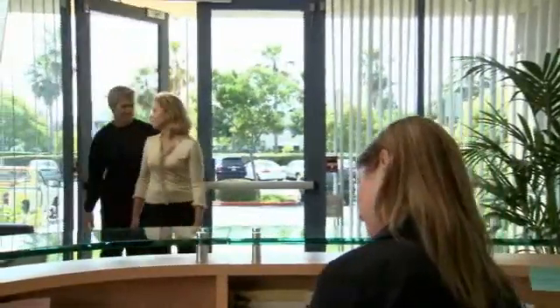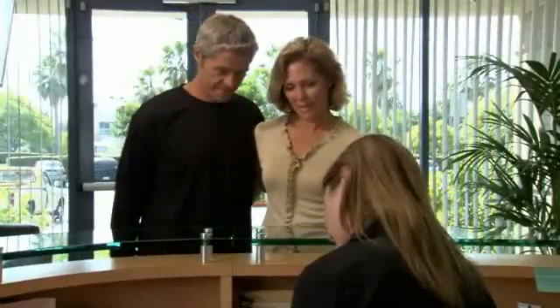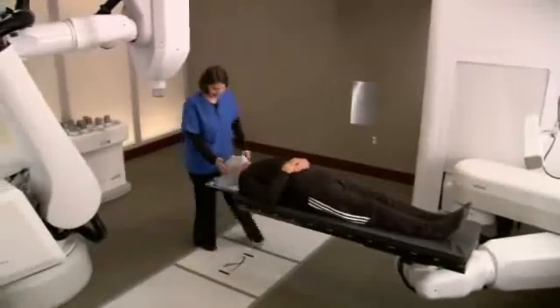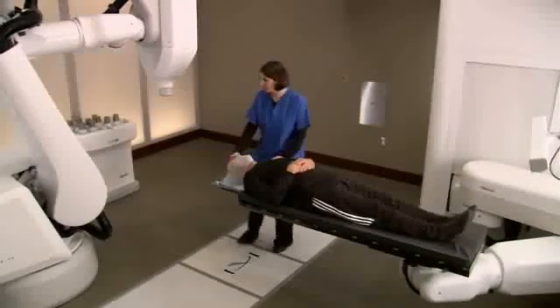For most patients, the CyberKnife treatment is a completely pain-free experience. You can dress comfortably in street clothes, and your center may allow you to bring music to listen to during the treatment. When it's time for your treatment, you will lie down on the treatment table while your custom-fitted face mask is secured into place.